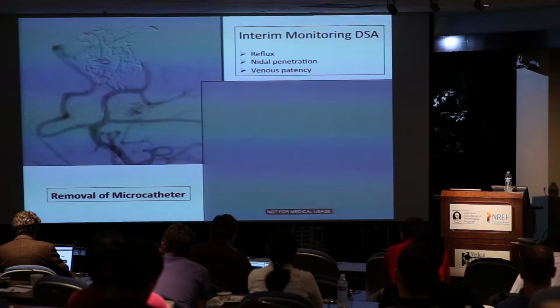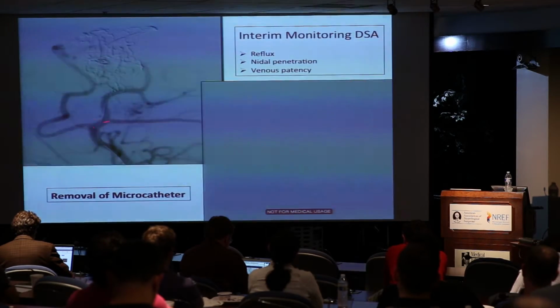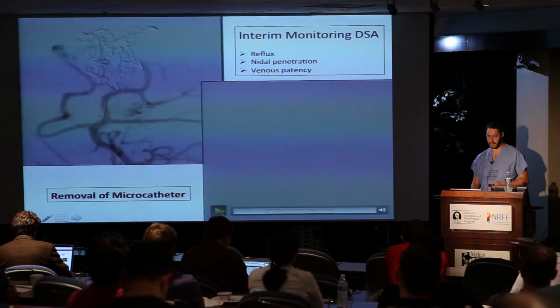This was Onyx 18 with a marathon microcatheter. And we went to several pedicles from this frontal branch and this other frontal branch that comes off of right here, the pericallosal artery. Okay, very important that you do when you're doing Onyx. Onyx can take a while, right? You've seen that down in the lab.